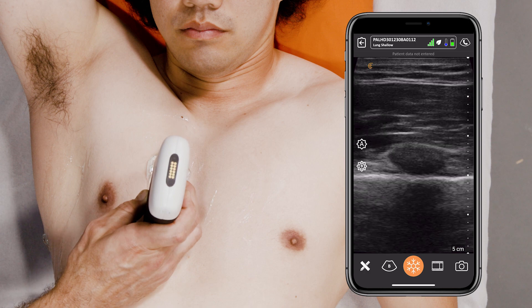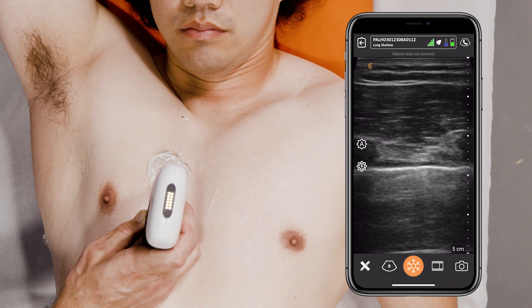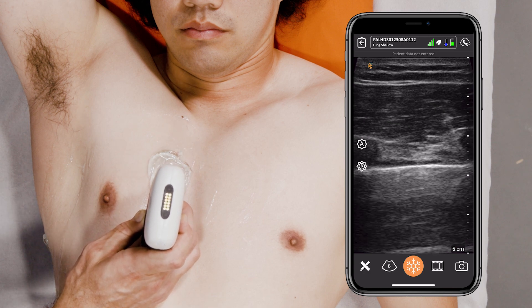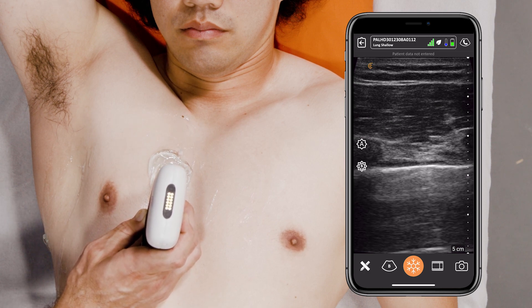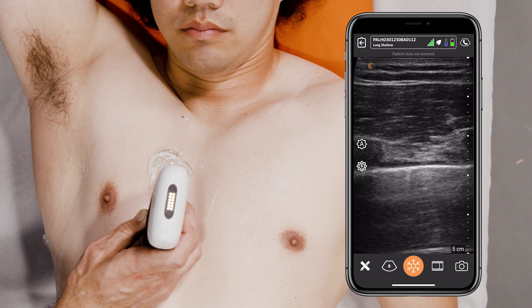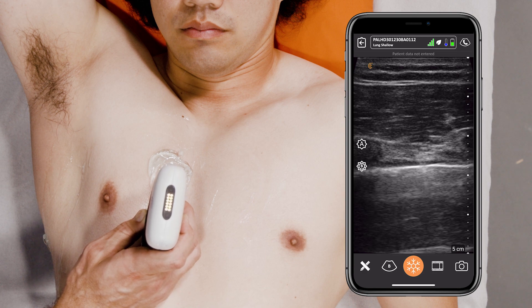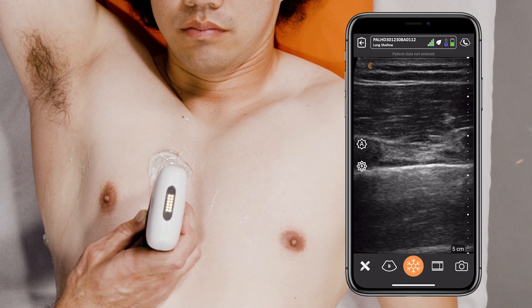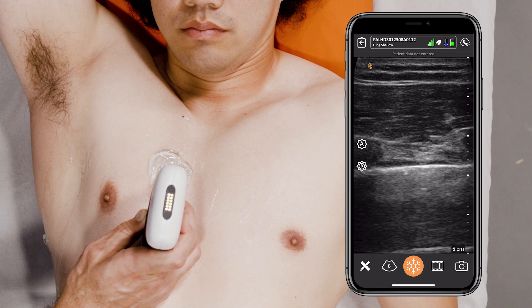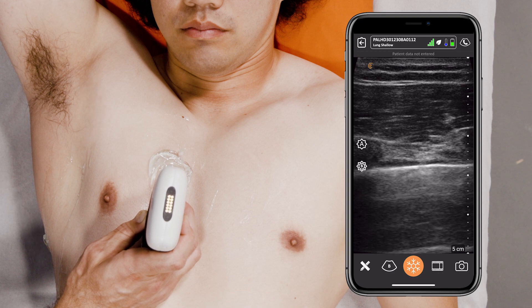You can move down another rib space. Once again you see those small comet tails — that's completely normal, indicative of lung sliding.